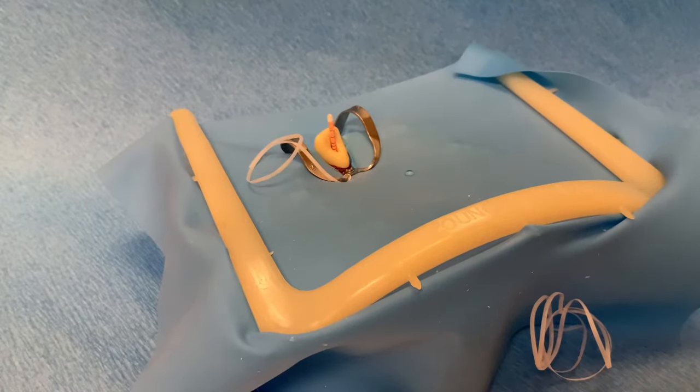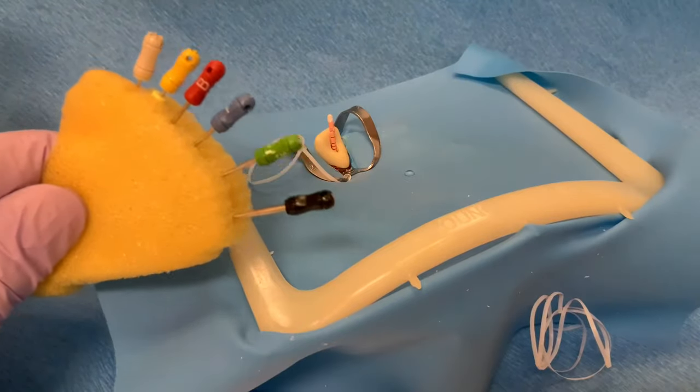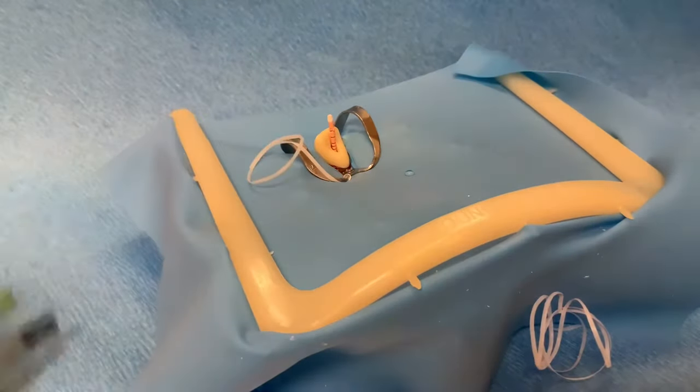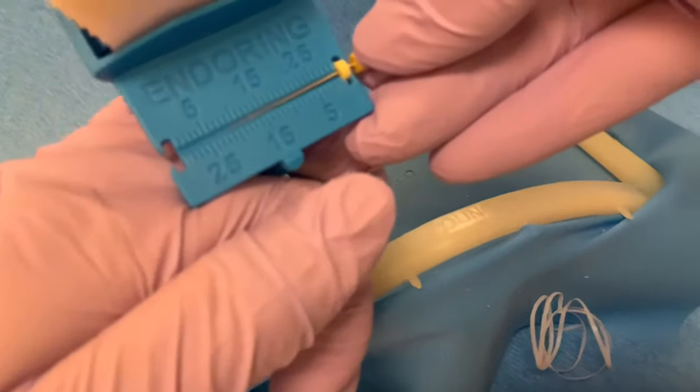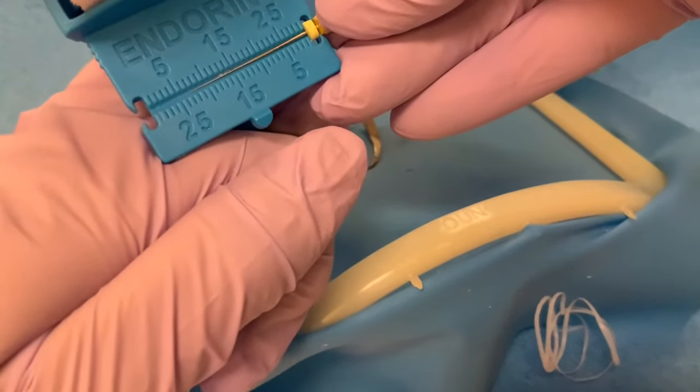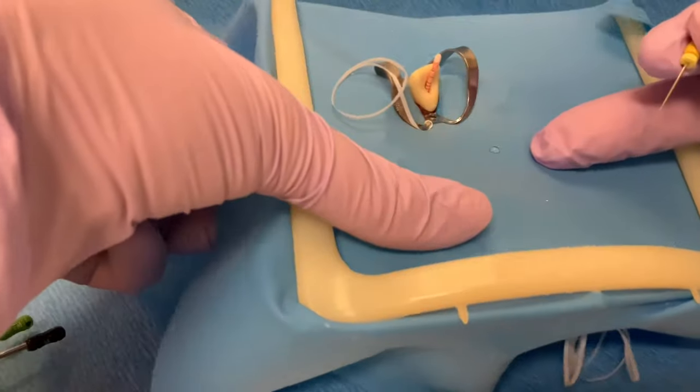For this step, hand spreaders or finger spreaders can be used. Finger spreaders provide better tactile sensitivity and they come in different sizes. Select a finger spreader and set a rubber stopper that measures 1-2 mm short of the working length. Ideally, the finger spreader should be inserted to this length for proper lateral condensation.